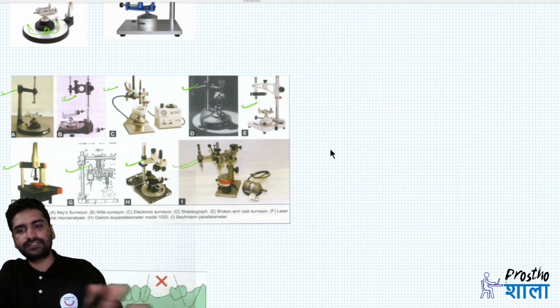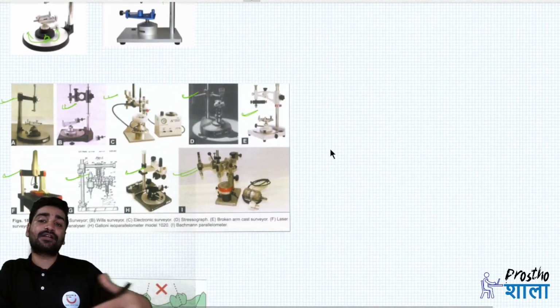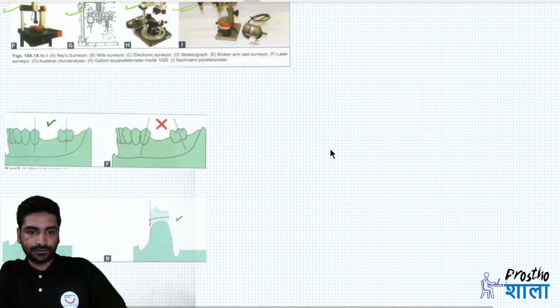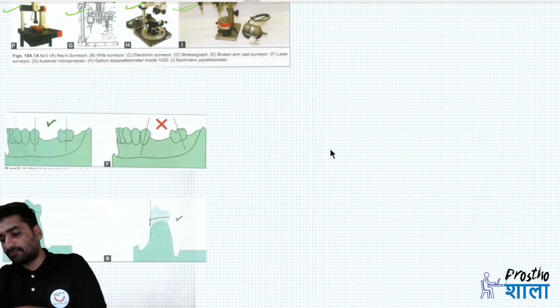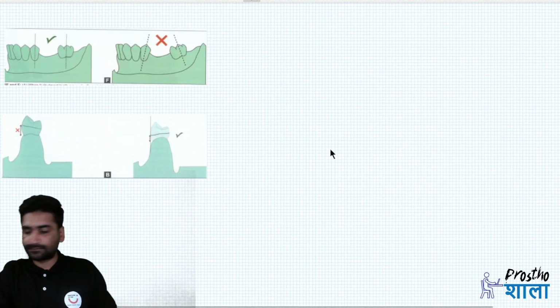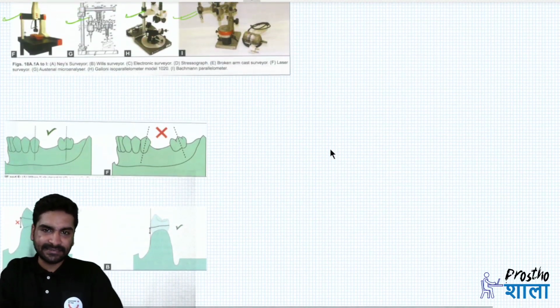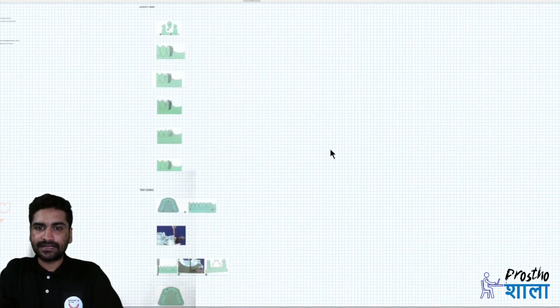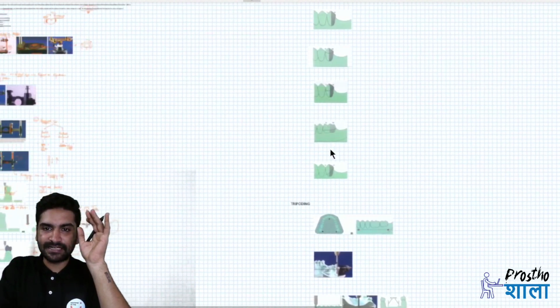You can use these 4-5 names so that you can show the examiner that you are also aware about other types of surveyor also. Correct? That is about surveying. Okay. Now the next thing which we'll study in the next coming topic is your survey lines, right? Survey lines will be taken in the next class.